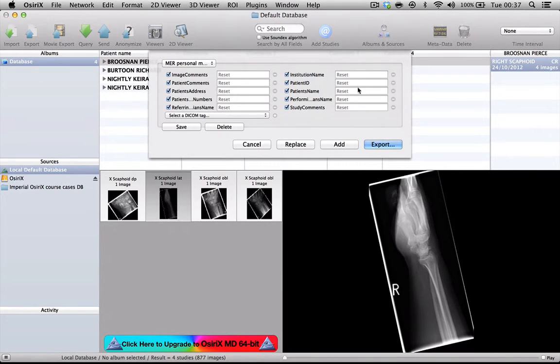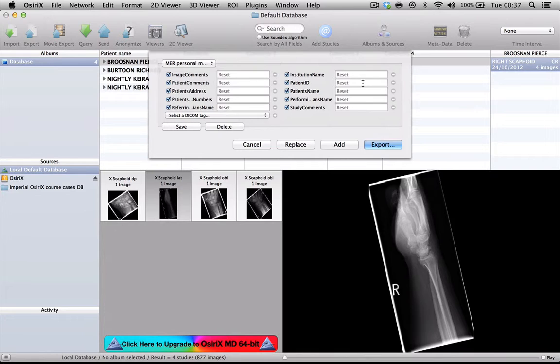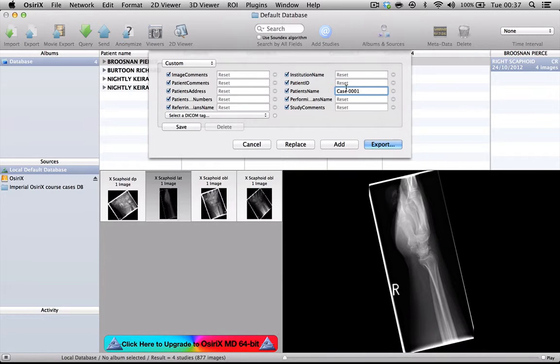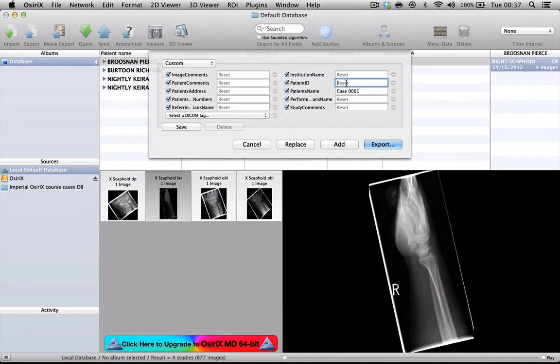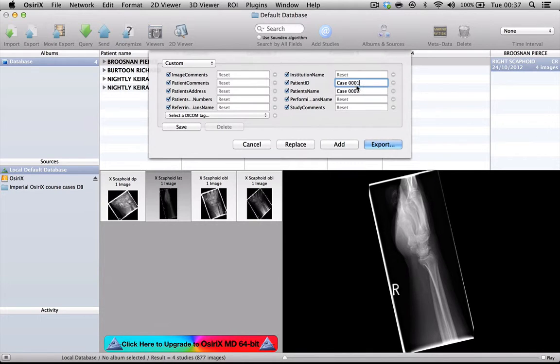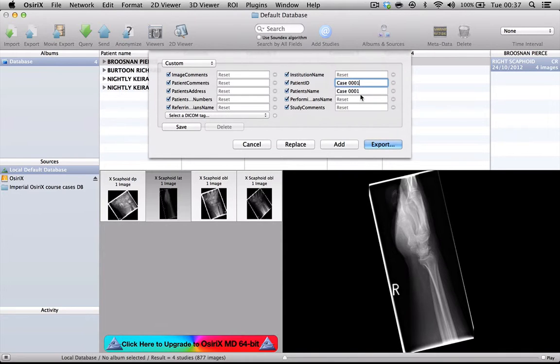We have the opportunity here, as we almost must do when we anonymize a patient, to give them an alternate number. Let's call this patient case 00001 and in the OsiriX user group by convention, we always give the patient ID number the same value as the patient name number. So we're going to call that 00001 and at that point, those will be replaced by the values that we have given and the rest of the information will be stripped out.